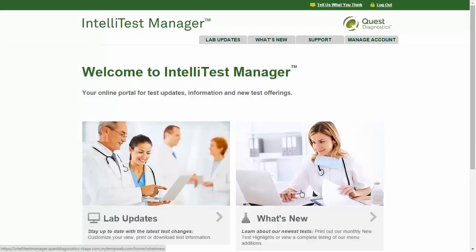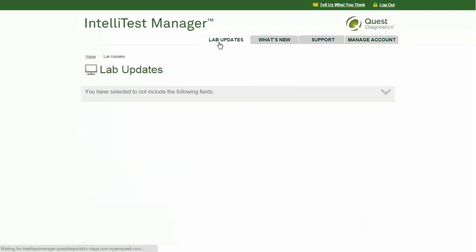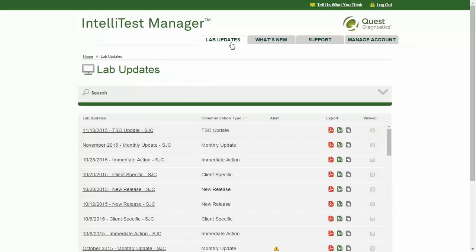From the IntelliTestManager homepage, you can access the following sections. Lab Updates: test update information is available in a variety of formats, and you can view, export, print, filter by account utilization, and customize the information to fit your needs.